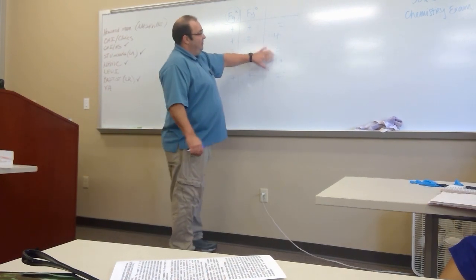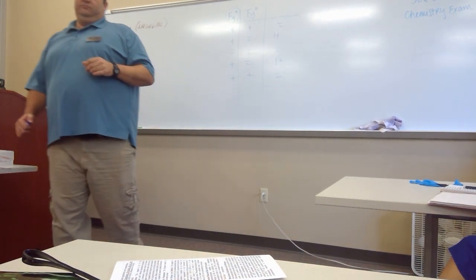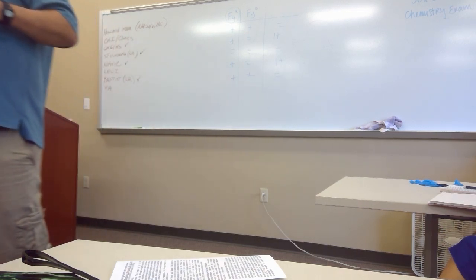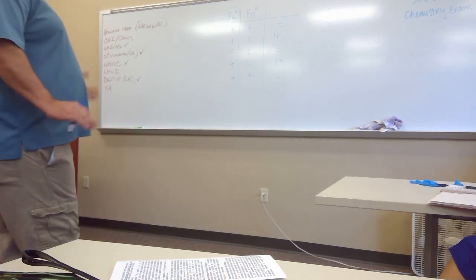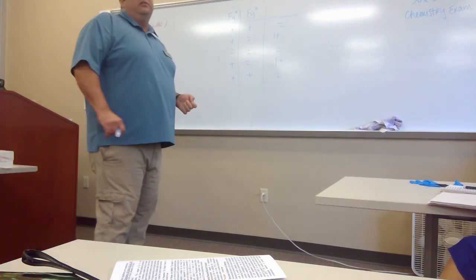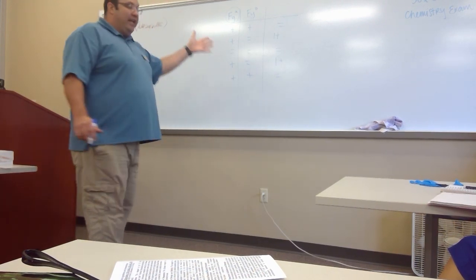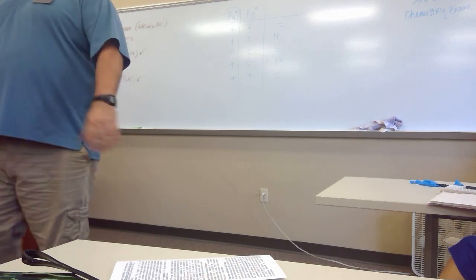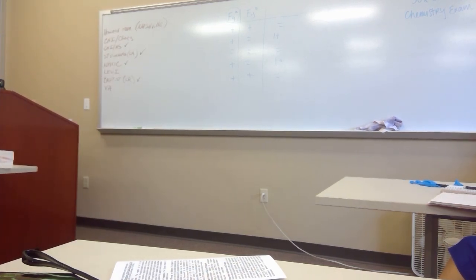So this might be too weak for us to even detect. That's when it's a problem. Then what? Then you start incubating longer, add enhancement, maybe go to the enzyme treated panels trying to enhance reactivity, whatever you can. Because once you get down to the point where you think, this has got to be a Duffy A, I just can't prove it, that's when you start doing that to try to prove it.